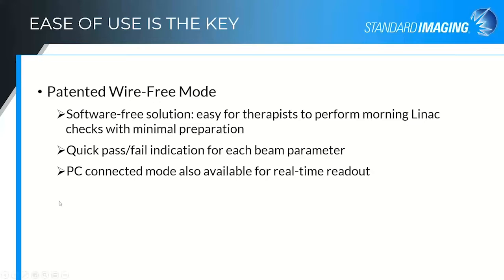I should note that there is also a PC connected mode. You can certainly run the device through the software and get more exact real-time information, and I'll show you some screens in a bit. You do get a little bit more information if desired, to see the data on the flatness and symmetry and constancy. So that is certainly available if you wish to do that.